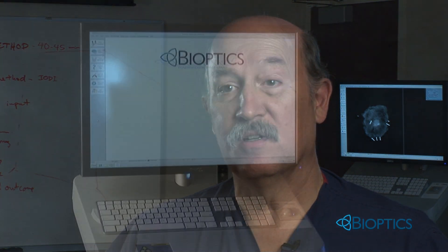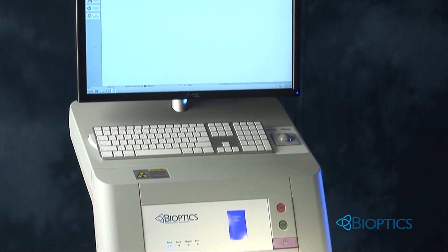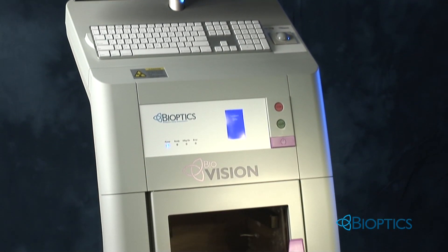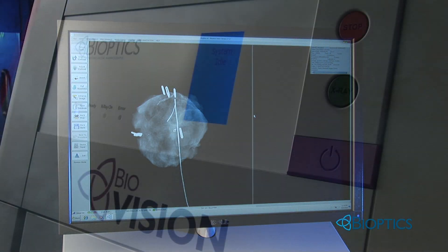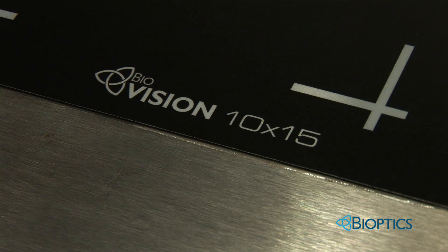The Bioptics BioVision digital breast specimen system is a self-contained device capable of delivering high-resolution images of lumpectomy specimens in minutes, right in your operating room.